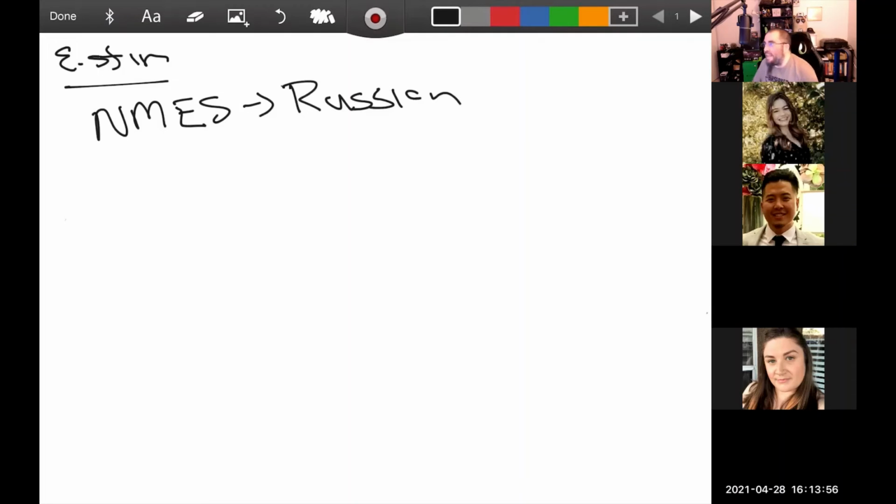So when I say NMES, it means neuromuscular electrical stimulation. You're triggering the nerves to cause the muscles to react. That's all it is. Most common is Russian. Again, I mentioned on the board, the second most common is VMS. In the clinic, you might see a company called Bioness. Bioness is just specialty NMES machines. They make special units for the wrist and special units for the foot. It's an NMES machine is all it really is.